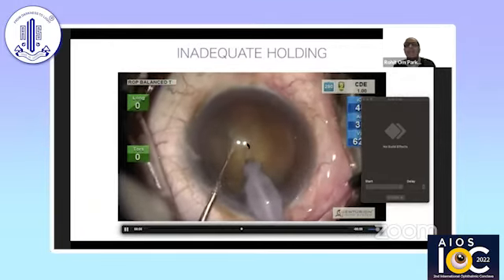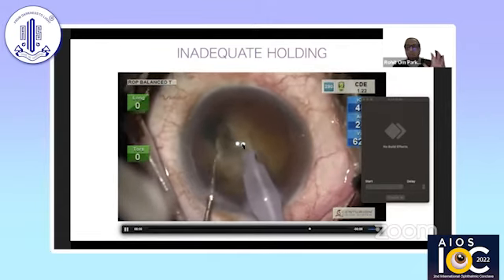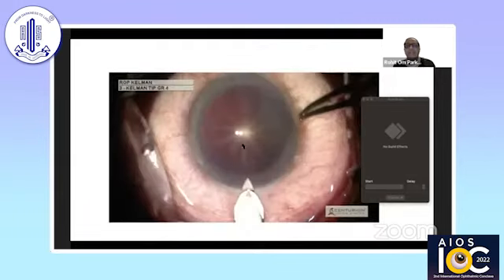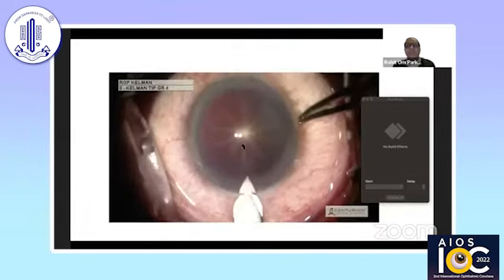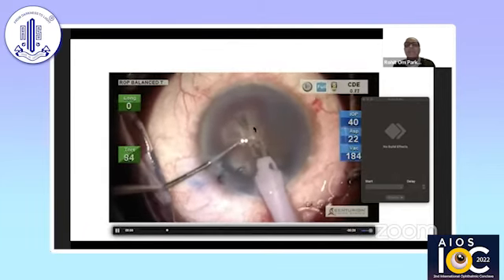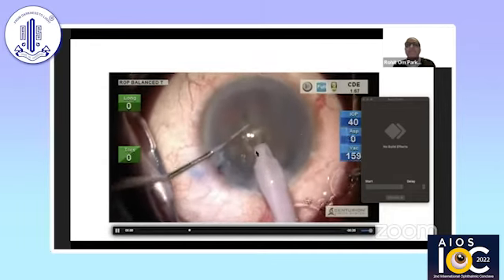There is an instability. So I go in again and then I chop it. So total good holding is very important in these cataracts. This is the rubra one, in which the anterior posterior diameter is less. So I'll create a small central crater. Anterior chamber depth was also less.